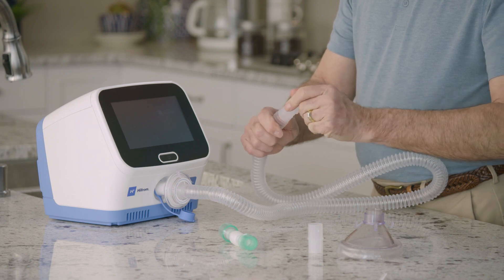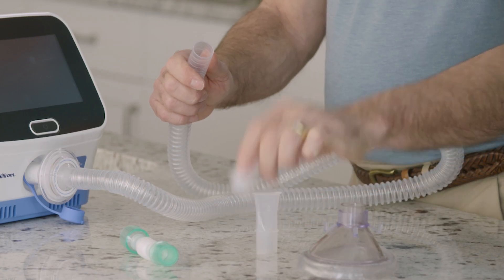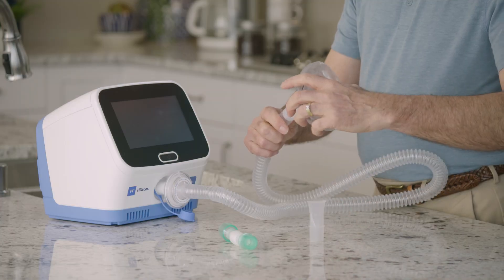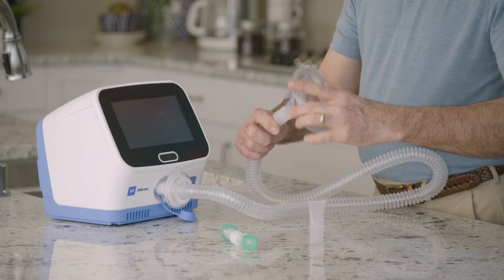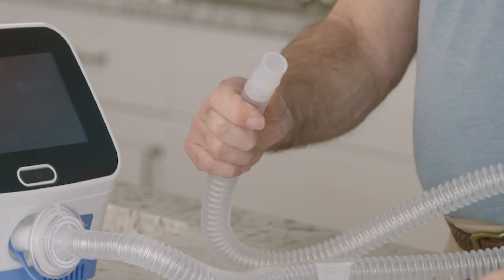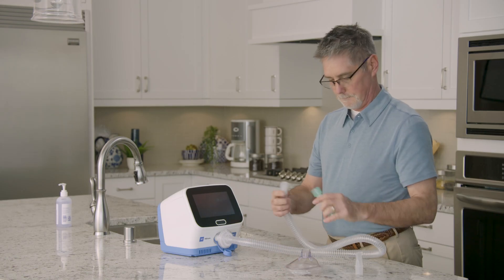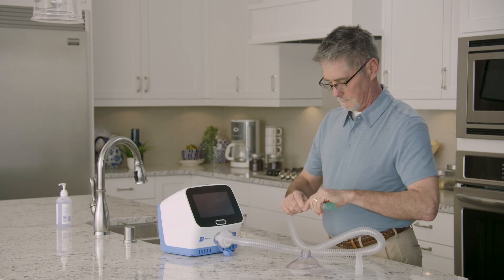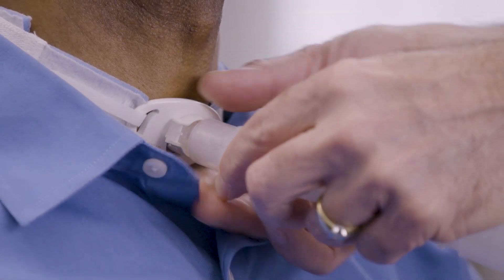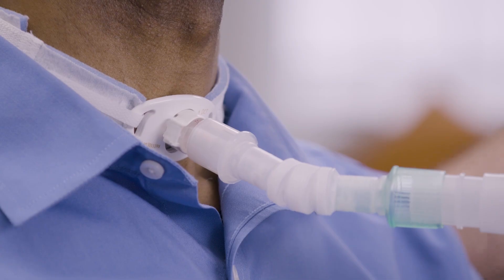For use with a mouthpiece, gently twist the mouthpiece into the free end of the breathing hose. For use with a face mask, insert and gently twist the adapter into the free end of the breathing hose, then connect the other end of the adapter to the face mask. For use with a patient with a tracheostomy, insert and gently twist the tracheostomy adapter into the free end of the breathing hose; the free end of the flexible tracheostomy adapter can then be attached to the patient's tracheostomy tube during therapy.